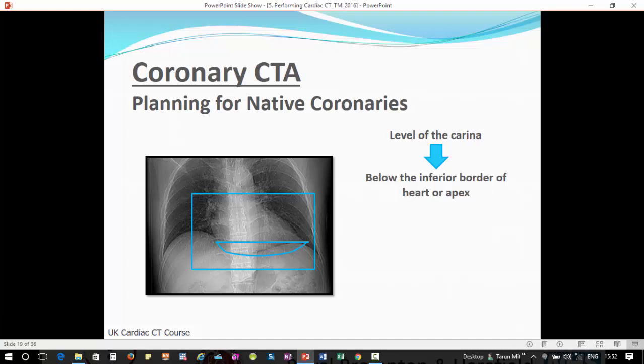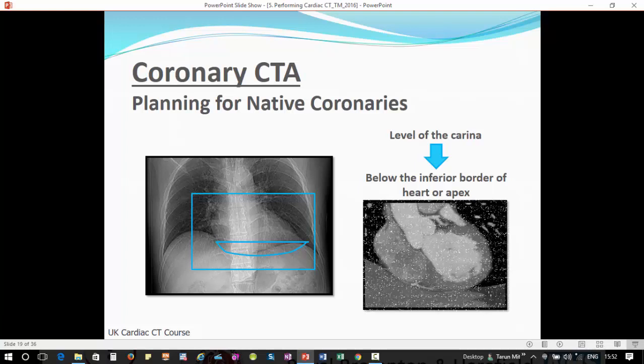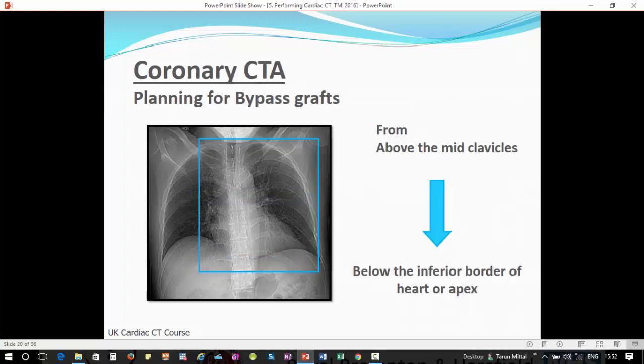So for native heart, we scan roughly the level of the carina to the apex of the heart. If you have done a calcium scoring scan beforehand, you can obviously use that to help narrow down your angiogram scan, so we can reduce the dose to the patient further. And we're going to get nice images, breath hold all the way from above the LAD all the way to the apex of the heart.